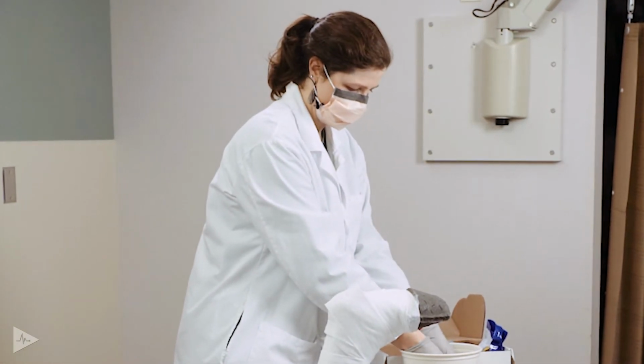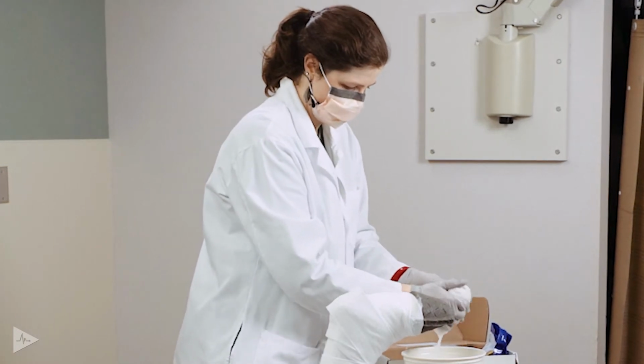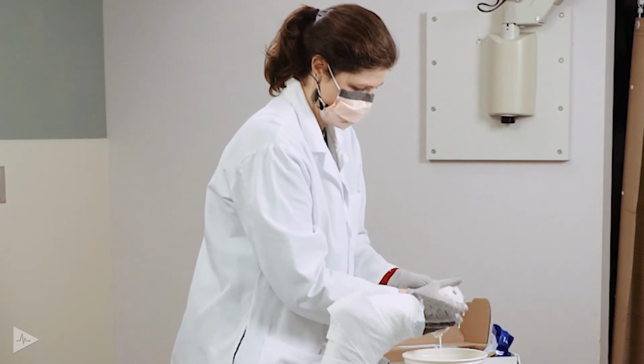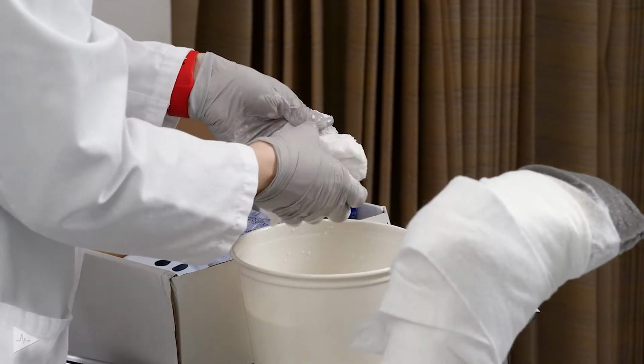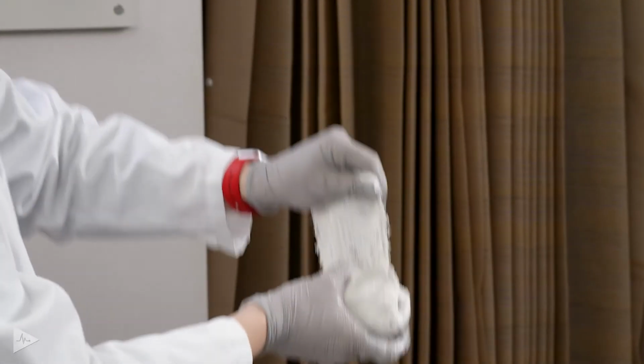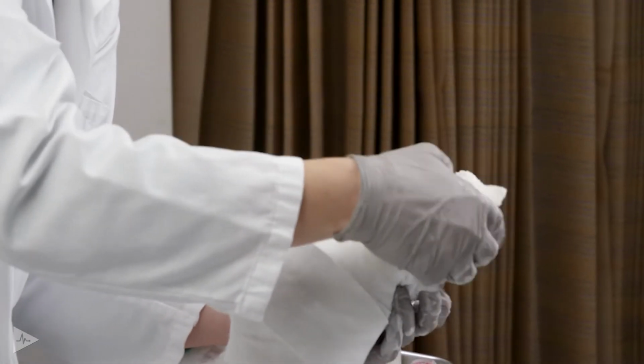Completely submerge in the water for a few seconds. Bring that back out and squeeze that out. We don't want any excess water. That's going to decrease the drying time if we squeeze out all that excess. So make sure you hang on to that leading edge. And then we'll bring that in and start just about the toe protector.